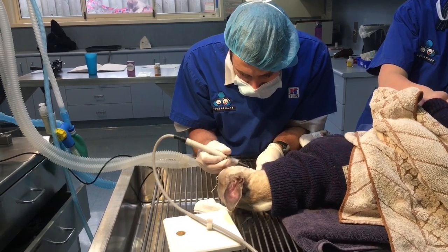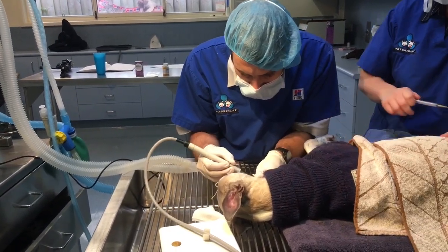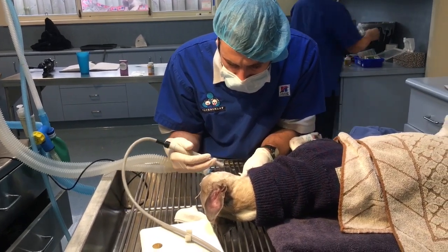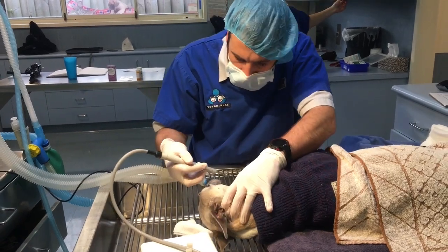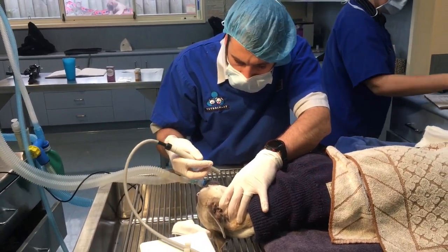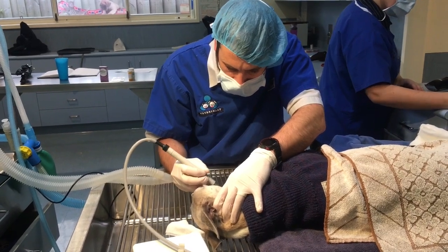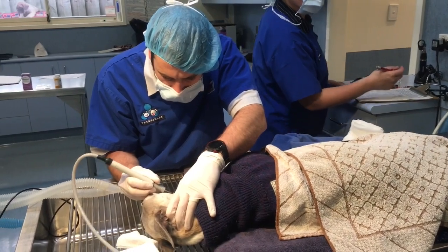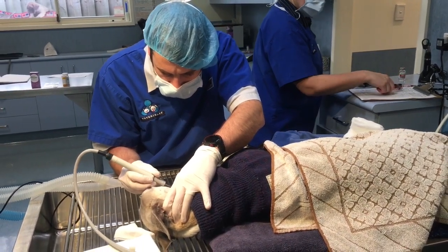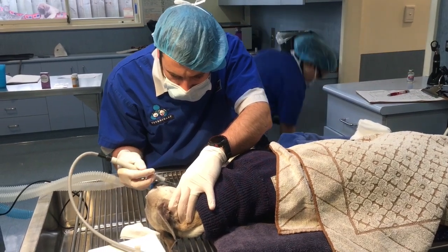How long have we been going? Fifteen minutes — fifteen minutes of dental time. So the answer to your question of how long will it take to clean up your dog's teeth — just a scale and polish — fifteen minutes. Sometimes it takes longer if there's really hard tartar or there's a lot of goo stuck in places, and it can take a little bit longer.